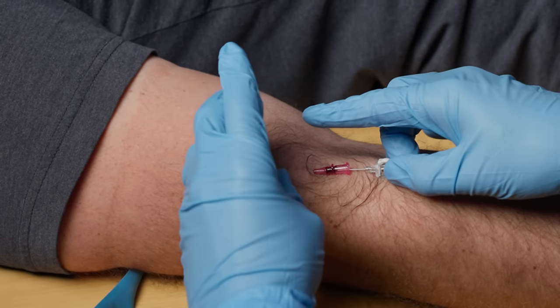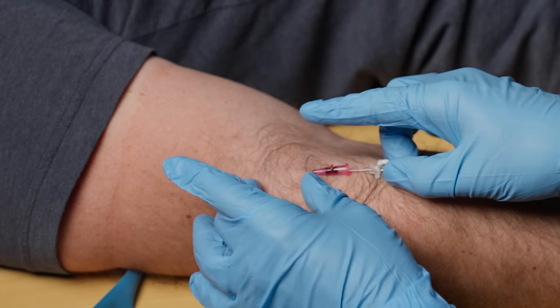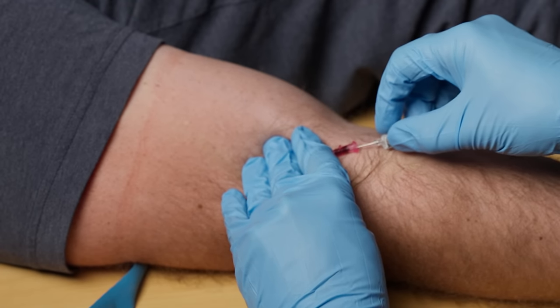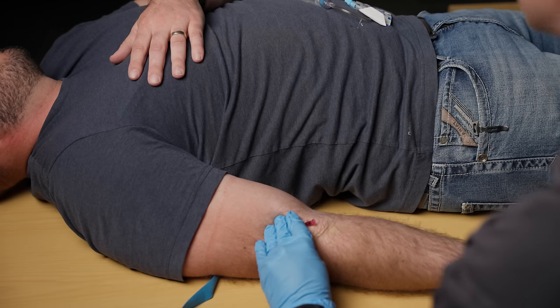I'm going to pop the tourniquet because that can become a mess and I'm going to hold tamponade. I want to hold tamponade beyond the plastic catheter because if I'm holding it right there it's not actually going to occlude blood flow, so I'm going to press pretty firmly. As I pull this out I'm going to retract the needle and put it in a safe place.